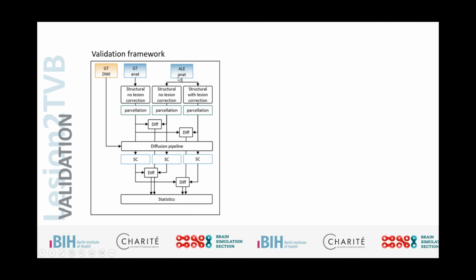without any lesion correction. Then we ran the same for the actual lesion patient, so we could see how the lesion impacts the processing without our corrections, and we ran it with the lesion correction to get results that would represent actually processing lesion patient data. And then with those 3 parcellations that we extracted, we computed agreement measures and differences between the ground truth and the not corrected parcellation, and the ground truth and the actual corrected parcellation. And then we compared the results that we had here.